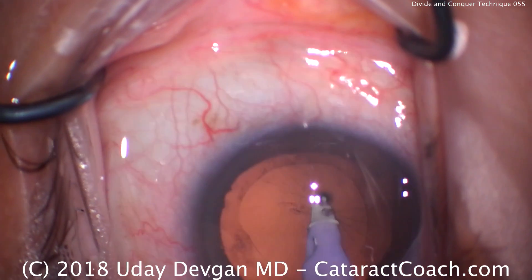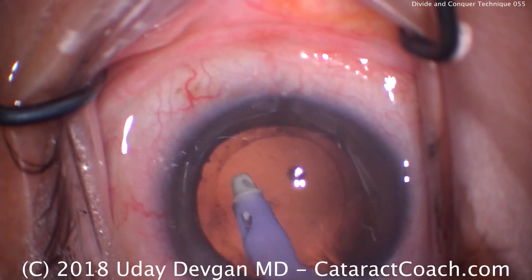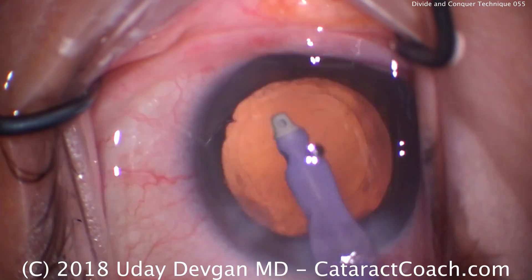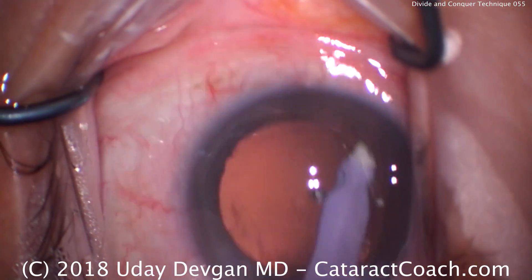Last bit of lens cortex coming out — there's the capsular bag, be careful there. A little bit of polishing — try to aspirate some of this material from the undersurface of the anterior lens capsule.